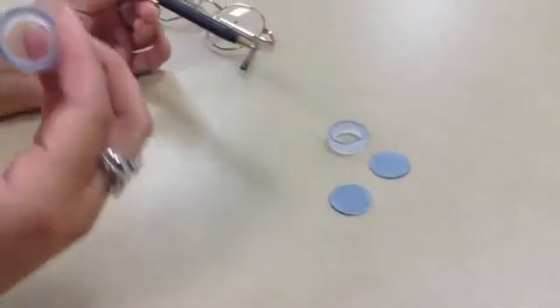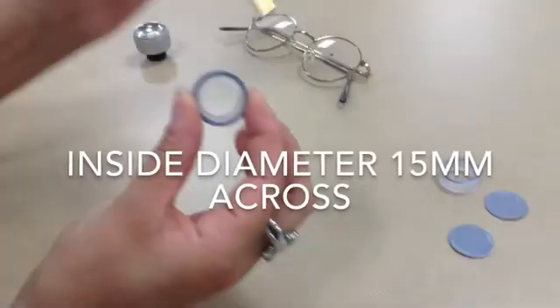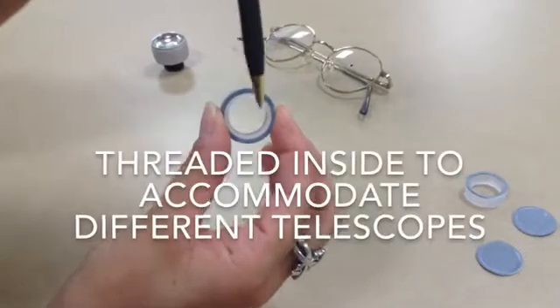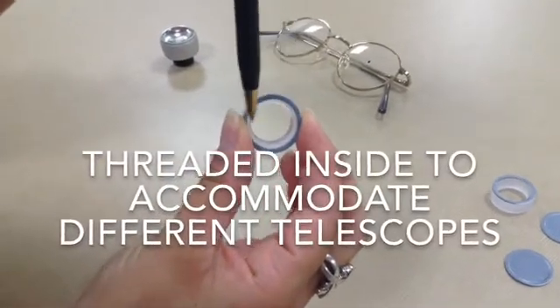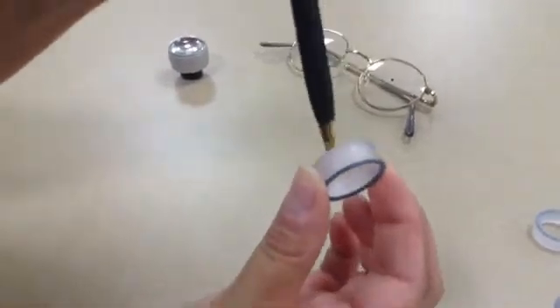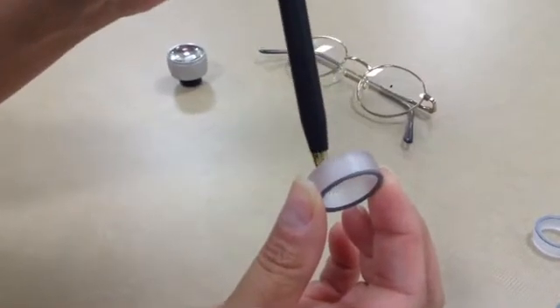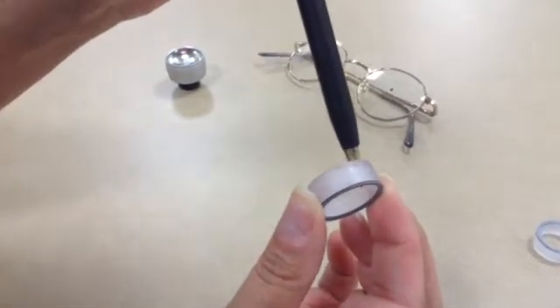Now the inside diameter of the Telescope Mounting Adapter is 15mm across, and on the inside you'll see that it is threaded, and that is designed to accommodate a number of different Galilean telescopes from Eschenbach.